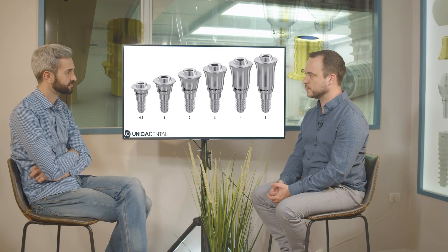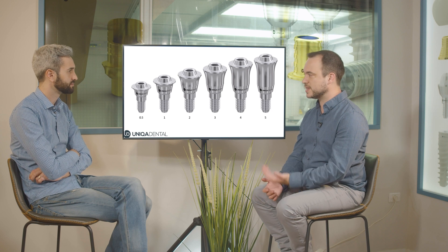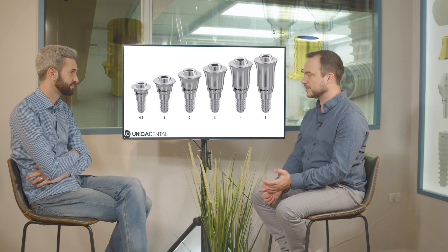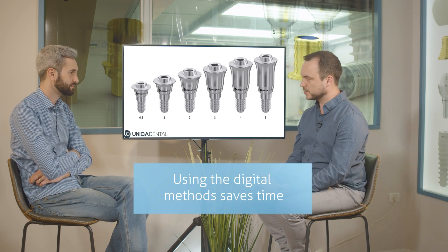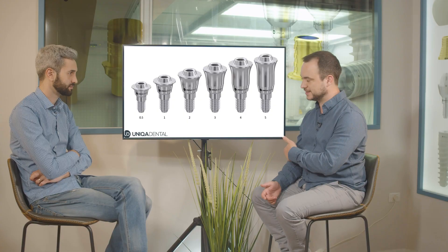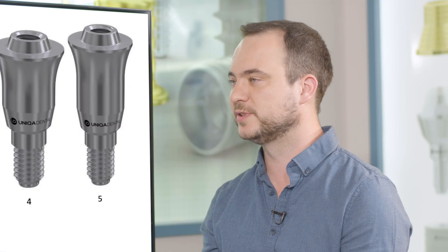You can do this with D-type as well — straight D-type, not angular multi-units. With all the straight multi-units you can do this without taking a second impression, saving another appointment. With one impression, the technician changes the height of the multi-unit in the CAD library, and the doctor on the second appointment changes to the new multi-unit height and screws the bridge that the technician made.